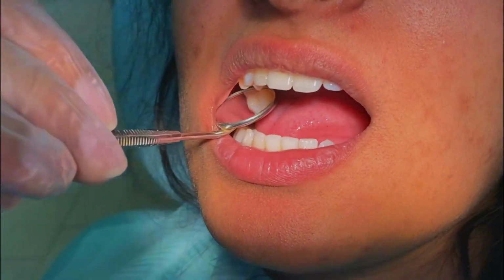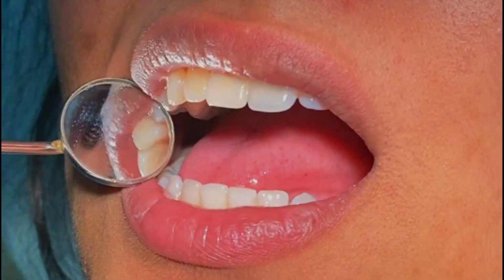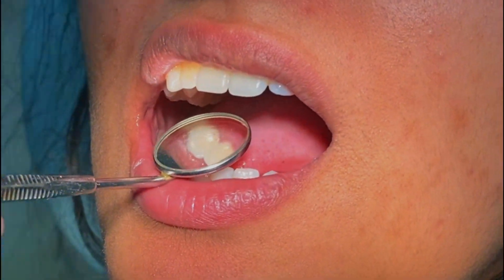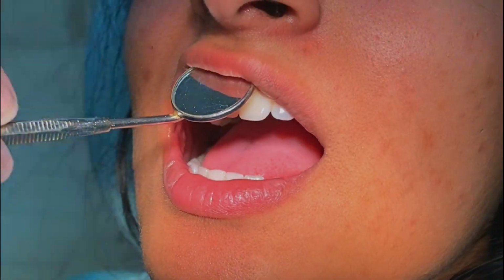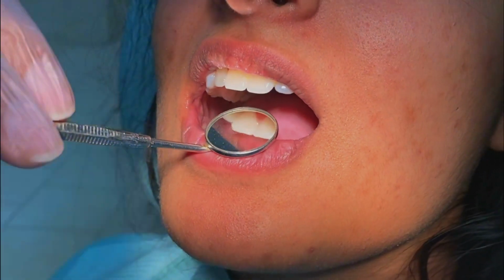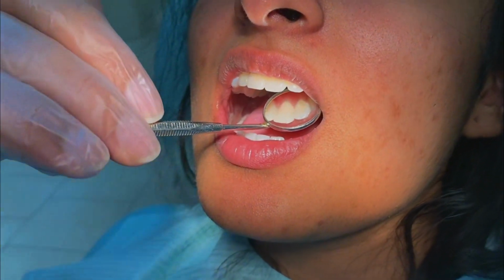It's pretty clean, very good job. 1-4 pretty clean. 1-3, doing a good job, that's the canine right there. 1-2 and 1-1. 1-2 is the lateral incisor, 1-1 is the central incisor. Just look at it from the front. Pretty good job. So this side was fine. That's good, and we're going to keep going to that side.